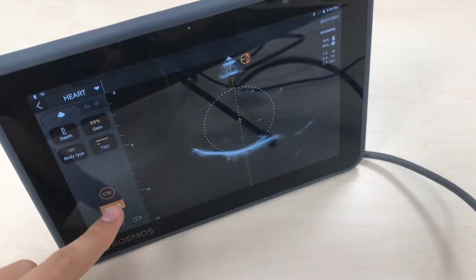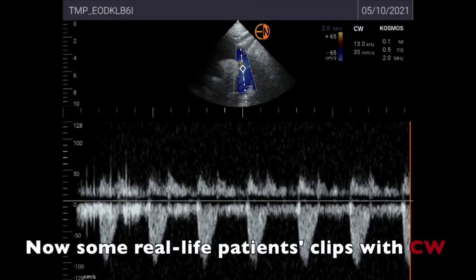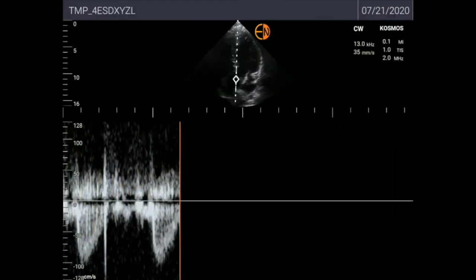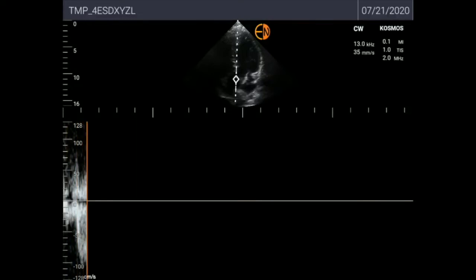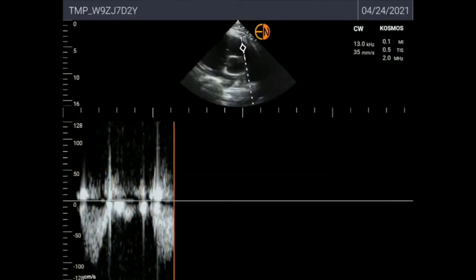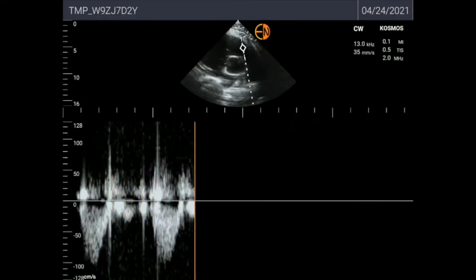I'm going to show you the continuous Doppler as well. Again, this is not the optimal view but it's the only one I can obtain on myself. This is a suprasternal notch view. And here you have an apical 5-chamber pointing at the left ventricle outflow tract, and here a parasternal short axis at the aortic level showing the right ventricle outflow tract.